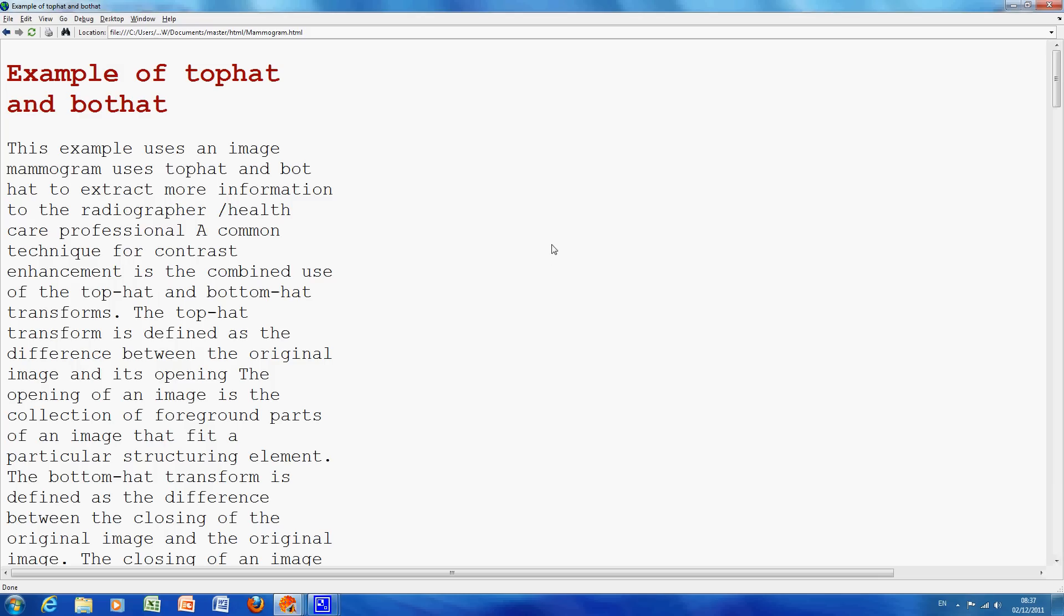Hello, welcome to Anselm Griffin's occasional series in MATLAB tutorials. Today we'll be looking at TopHat and BotHat.